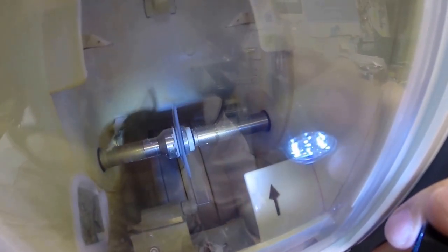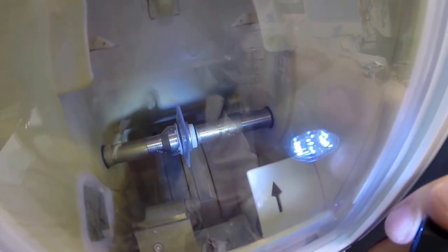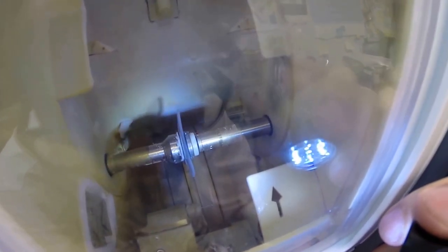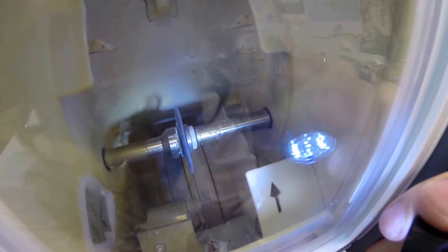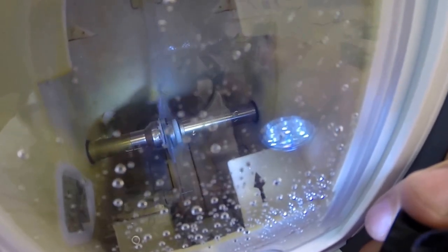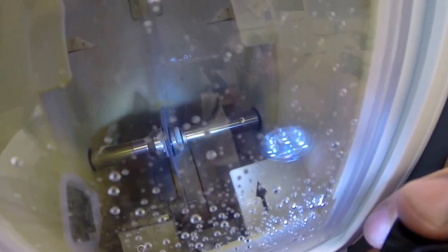Now again, you need no distance correction. You only wanted these as reading glasses, but you wanted to be able to wear them all the time. So that's why we put you in a bifocal that has a clear non-prescription top, just like a window. It's going to be absolutely clear with no prescription. And then a 1.75 reading power at the bottom. Now, if you need these for a computer, anyone watching, I can put just enough in the top and just enough in the bottom so that the keyboard is clear.